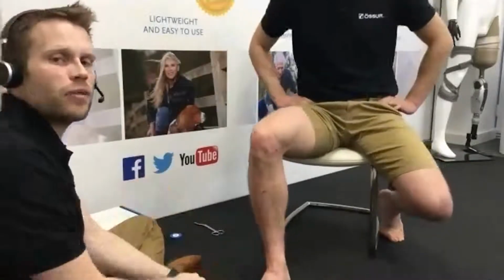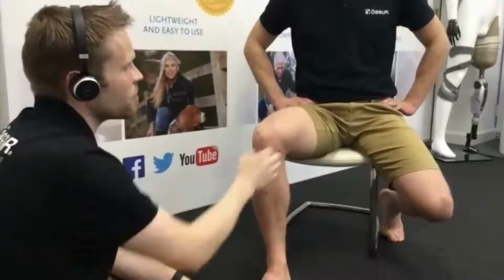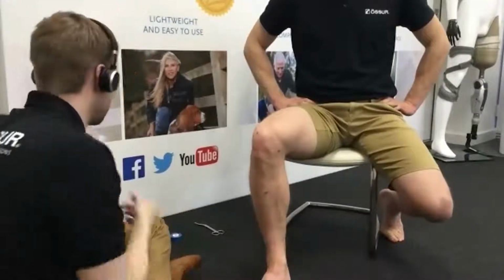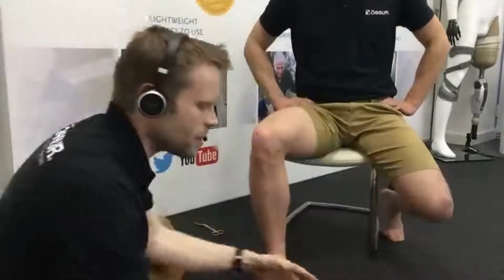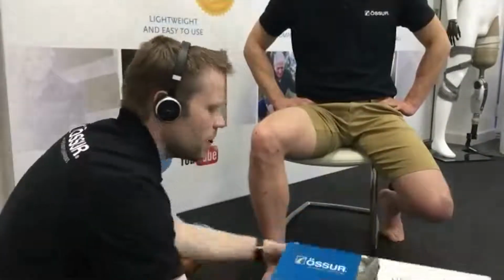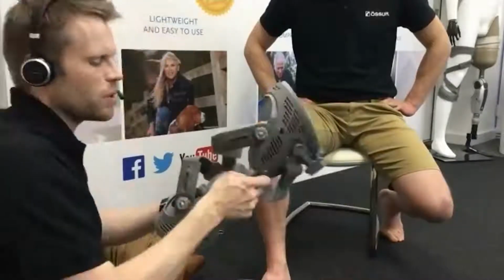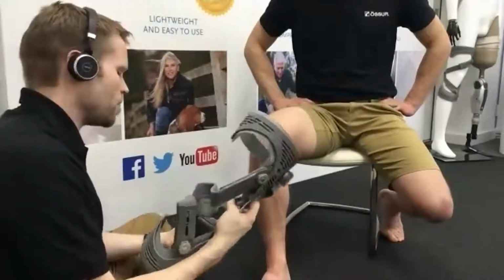We do have lateral versions as well as medial versions, but in this case, Pete has a medial compartment issue. Okay, we now have our brace. So our brace is in the box there. Just get rid of that one. And you can see it comes with the straps in position.